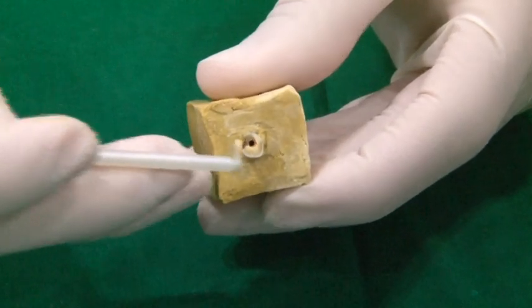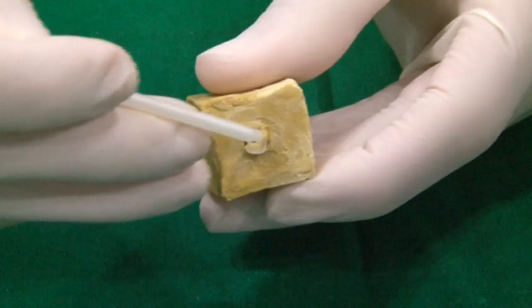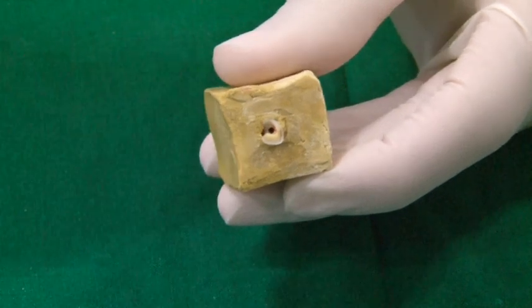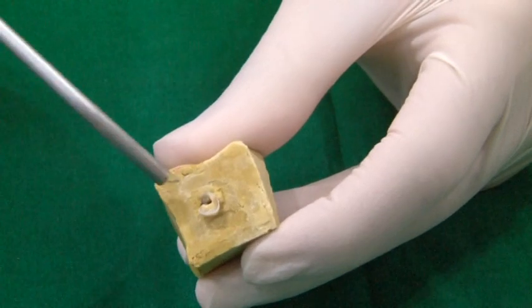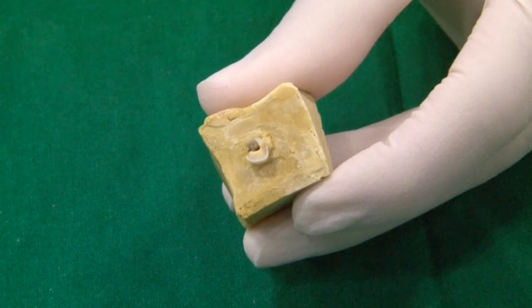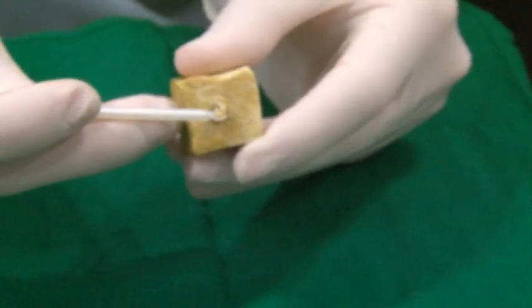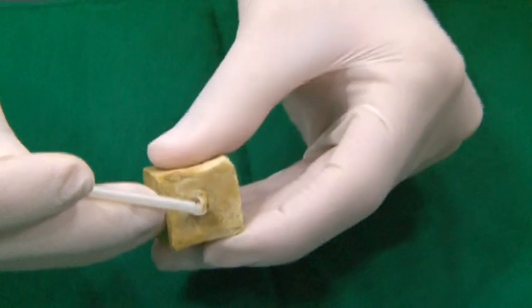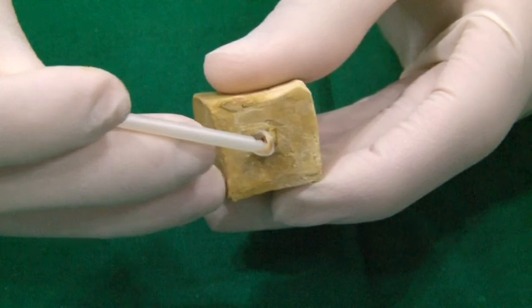Apply one or two drops of the pre-bond on the etched tooth surface for 20 seconds. One can use a thin applicator tip followed by a thin brush to ensure that the bond is applied meticulously in the post space. Remove excess material with a paper point and air blow gently. Bond A and Bond B is mixed in a 1-to-1 ratio for 5 seconds and applied on the tooth in a similar manner for 20 seconds and air dried gently.